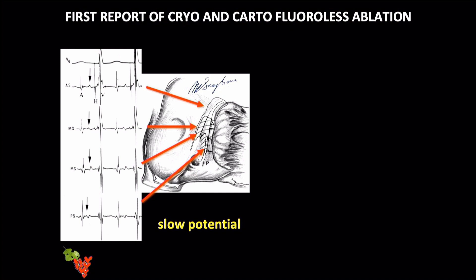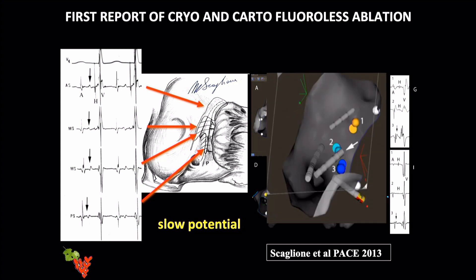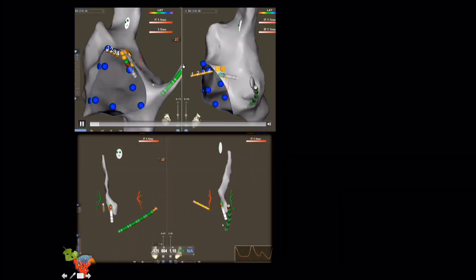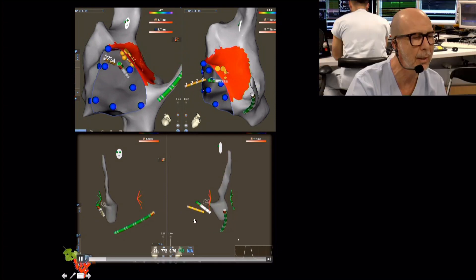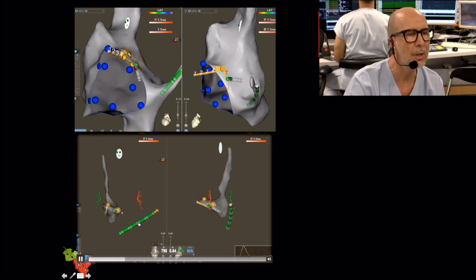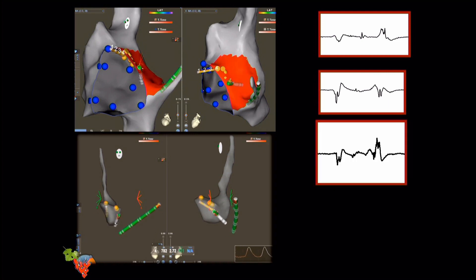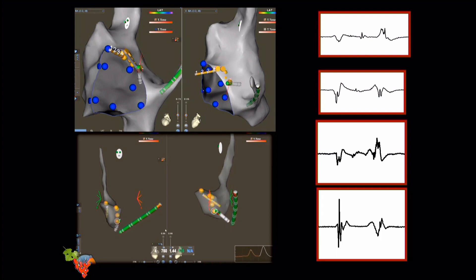Zero fluoro is not only about eliminating radiation — it also enables 3D reconstruction of the triangle of Koch for that specific patient. You can tag the coronary sinus ostium with the catheter inside, tag the His bundle recording, the compact AV node potential, and finally the slow pathway potential, unveiling the real anatomy of that patient. This can be done with a full chamber reconstruction or just in a biplane view mimicking fluoroscopic projections, placing tags for the His position, AV node, and slow pathway.